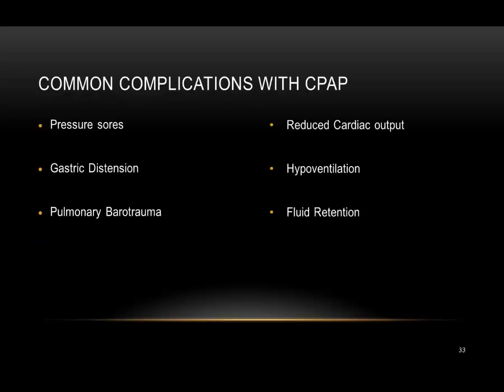Some of the common complications associated with CPAP include pressure sores. Since the advent of soft, self-sealing masks, these complications are usually limited to nasal bridge pain and erythema at the site of application. However, these symptoms can be reduced by the prior application of materials such as Granuflex. Another less serious complication of the mask is patient discomfort or intolerance.